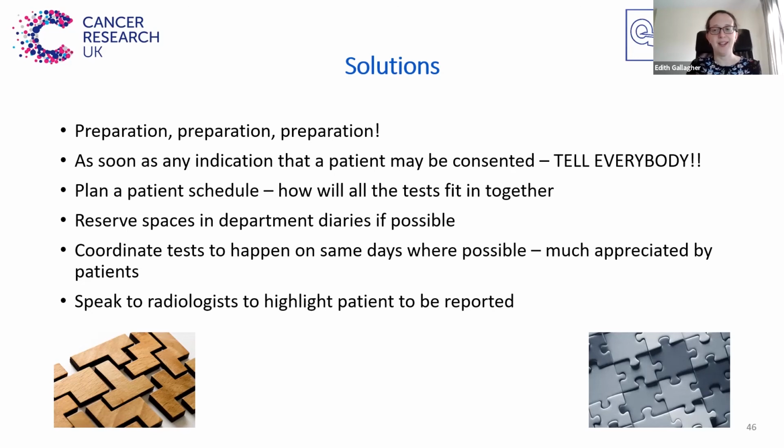Once you have a plan, some departments may allow spaces to be reserved in their diary. I have found that this is always easier, and it's easier to cancel a space than to try and book one at the last minute.